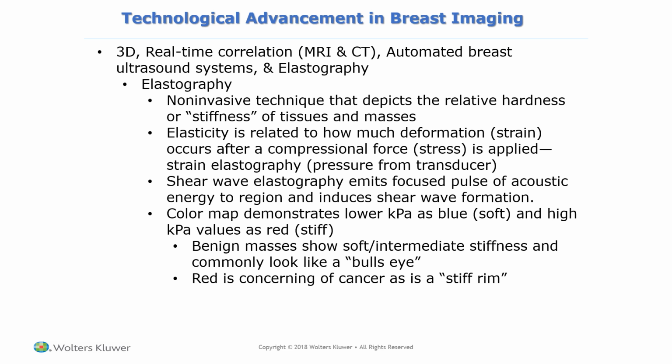So you're having the soft tissue detail from the MRI, and yet you're adding things like attenuation properties and vascularity from the ultrasound. There's also automated breast ultrasound systems where the breast is placed in basically a bath of water and an automated approach. So you wouldn't technically be doing the scan at all. It would be automated and create an ultrasound view of the entire breast.